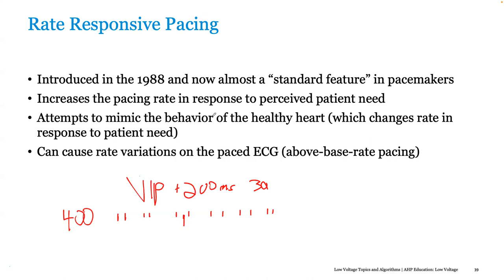Yes. The Sphera we get in Nigeria has a Search AV feature, but does not have the MVP or the AAI mode. But the point is, Elvis, you can use AAI to DDD. If it's an intermittent complete heart block, it will search the AV node over a few cycles, and if it goes into complete heart block, it will switch to DDD on its own. So all the Medtronics have got that.